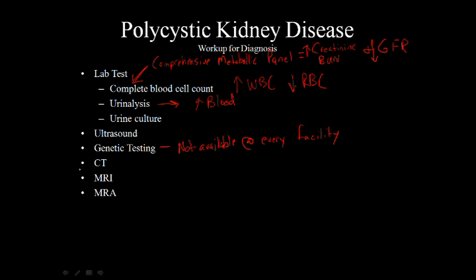But usually we favor CTs simply because it's very simple to perform. We can get the results back. MRI and ultrasound after the CT has actually yielded some results then prove very valuable as well. But CT, even CT without contrast, can yield a very diagnostic result for polycystic kidney disease. And then you begin piecing the puzzle together.